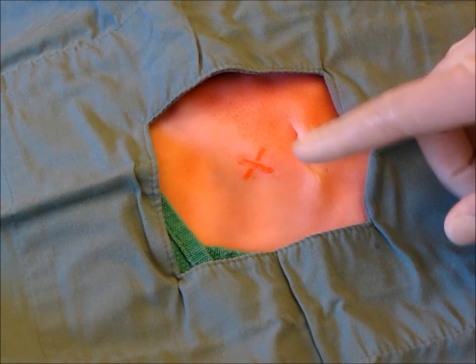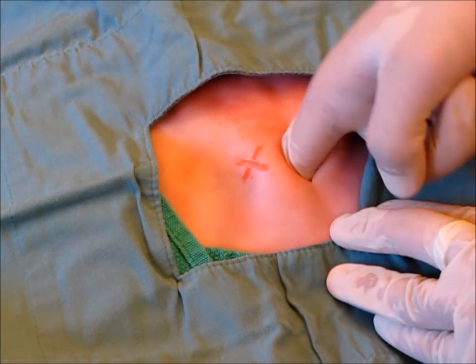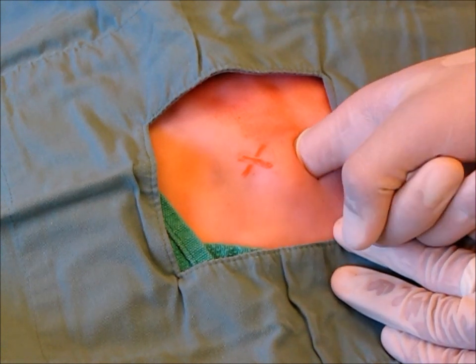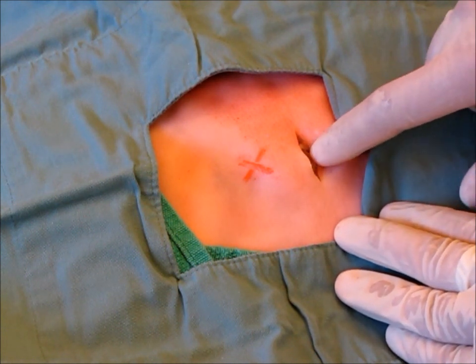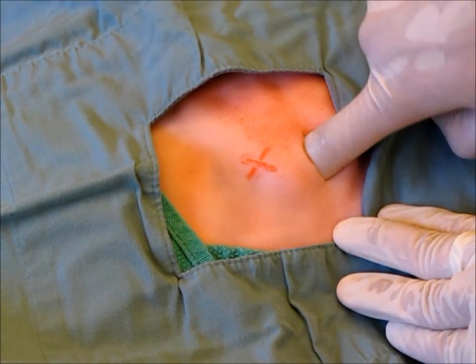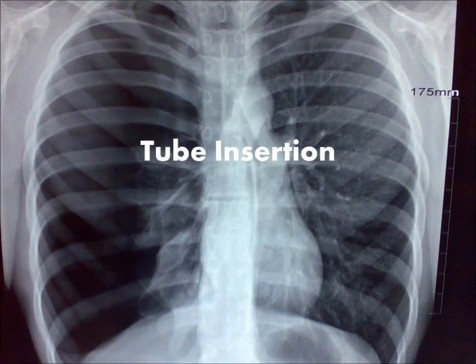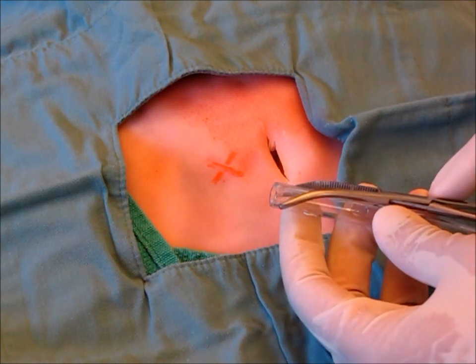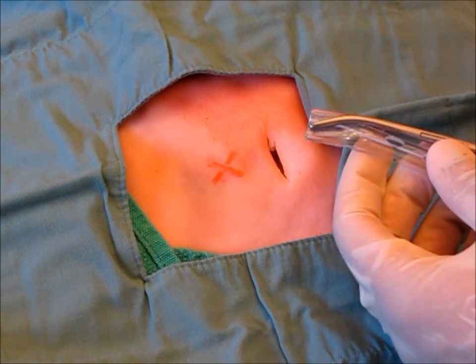Next, insert your finger through the subcutaneous tract and into the pleural space. Ensure that you are indeed in the pleural space and that there are no significant adhesions. If you do encounter significant adhesions, stop and consult ultrasound guidance or CT guidance, or choose another chest tube location. If there are no adhesions and you're sure that there is a clear tract, retract your finger and ready your chest tube. Using the kelly, clamp at the very tip of the chest tube — the kelly will aid in positioning the chest tube inside the pleural cavity.